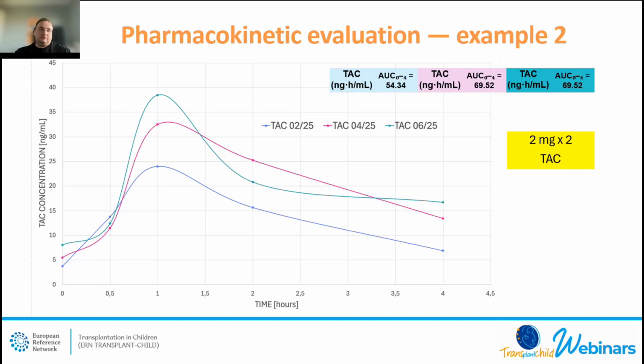And we may monitor the adherence if we can. If we want to, we may calculate the concentration to dose ratio.